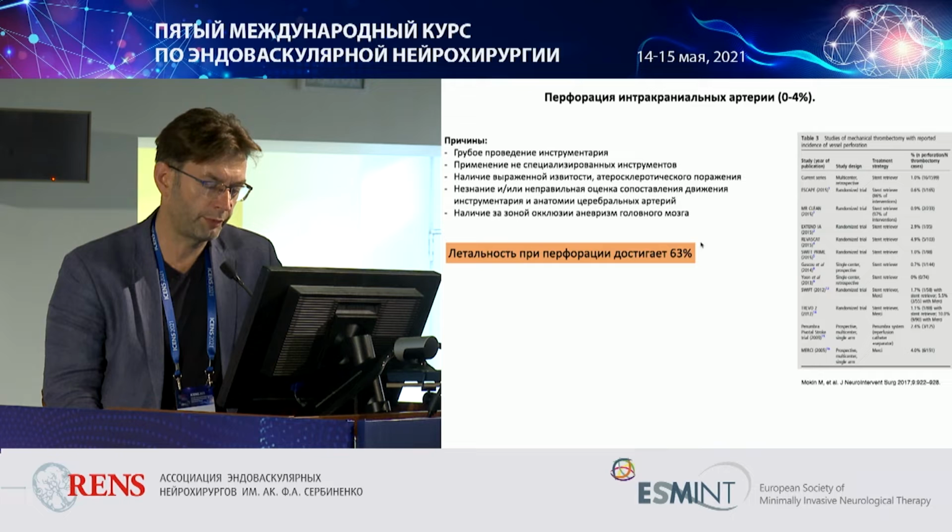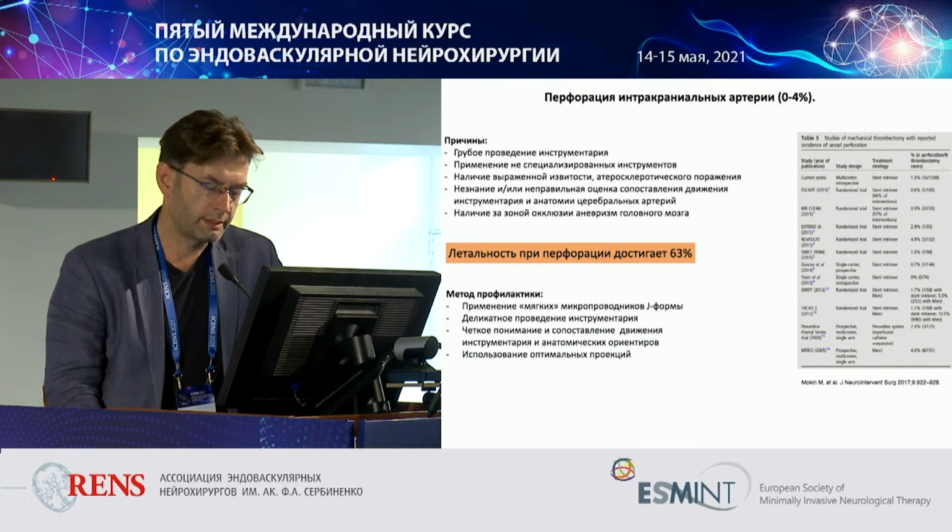The reason for such a complication is quite rough performance of the procedure using non-specialized tools, the presence of significant tortuosity or atherosclerotic plaques, improper assessment of the tools used and the cerebral anatomy, and sometimes you can perforate the vessel beyond the zone of occlusion.